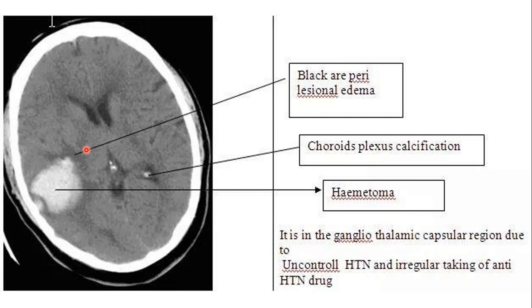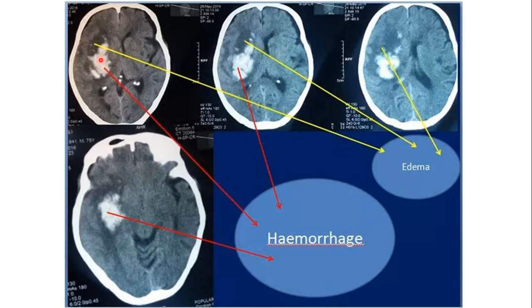Most of the time, not always, hemorrhagic stroke at the basal ganglia is due to uncontrolled hypertension, which causes rupture or bleeding from this arteriole. Here is a patient with uncontrolled hypertension — an intraparenchymal hematoma at the right basal ganglia distribution, most likely from the lenticulostriate branch of the right MCA. It is surrounded by edema causing mass effect on the adjacent ventricle with possible midline shift, and the overlying sulci are effaced. The hematoma extends over several CT sections, indicating it is quite large.